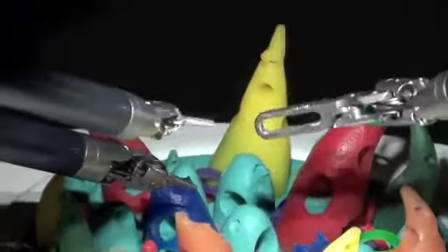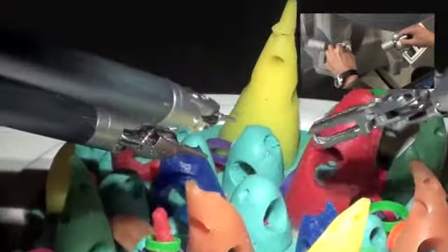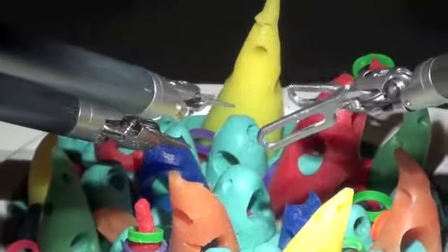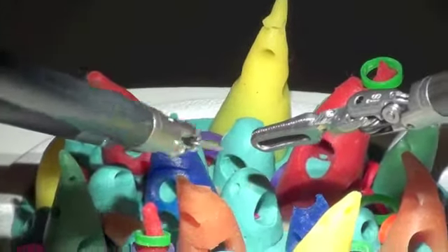Another feature of this is a feature called scaling, where very large movements of my hands, right now I move my hands about 8 inches, but I'm only moving the instruments just a few inches, so I can reduce tremor and get very precise with what I want to accomplish.